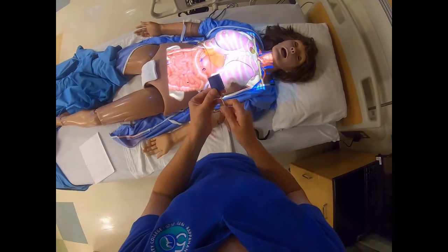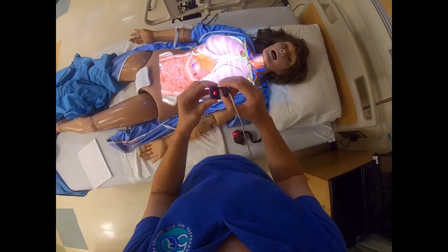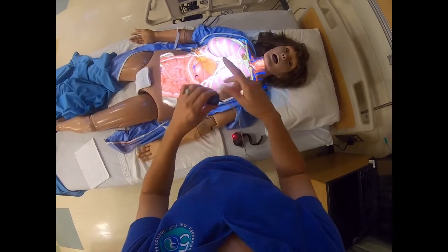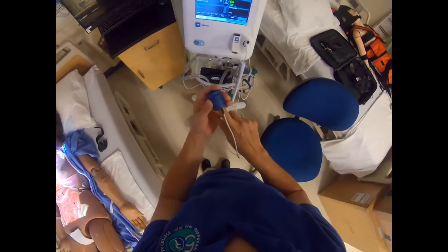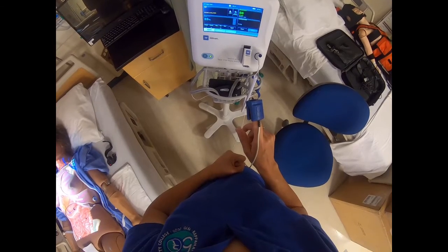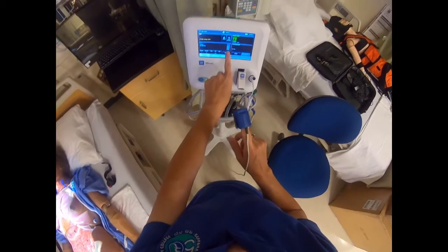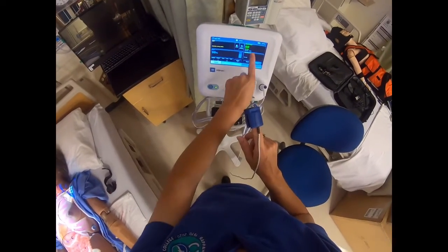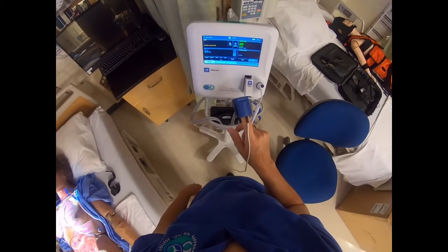So this is what the sensor looks like when it is totally put together. And inside is the little infrared light that you see. And what we do is we place our patient's finger in there. And as you see on our monitor over here, it will start tracking my pulse. You can see the bar over here going up and down, as well as the percentage that is saturated. It will also give my heart rate because it does sense that as well.